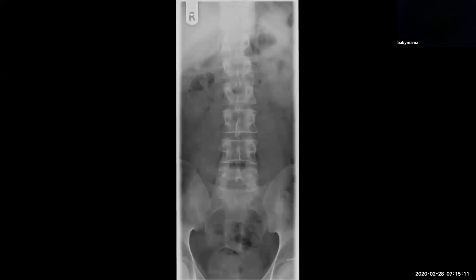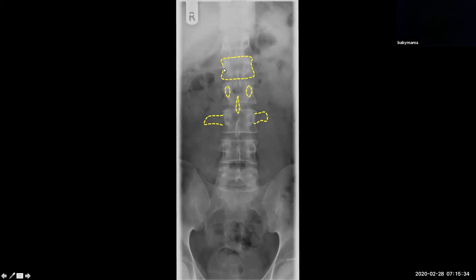Before we get into the cases, I wanted to share a normal frontal radiograph and highlight some of the anatomy we should all be familiar with. On this frontal radiograph, we can see the vertebral bodies outlined. This patient has five non-rib-bearing lumbar type vertebral bodies. Using the L2 vertebral body, we can trace out the pedicles — the posterior elements of the vertebral bodies. We should have two pedicles per vertebral body.